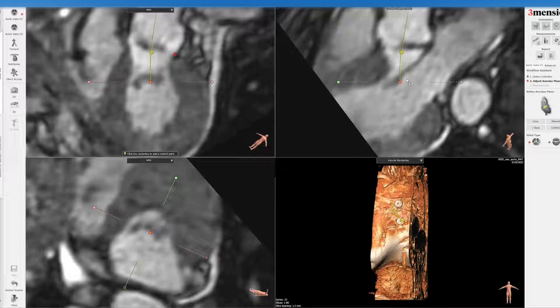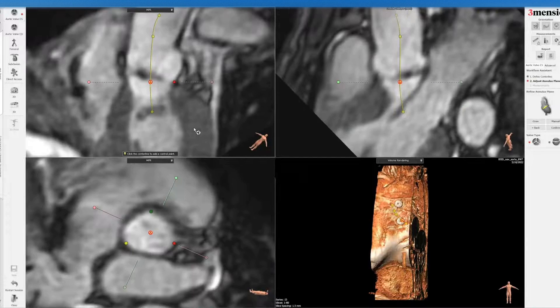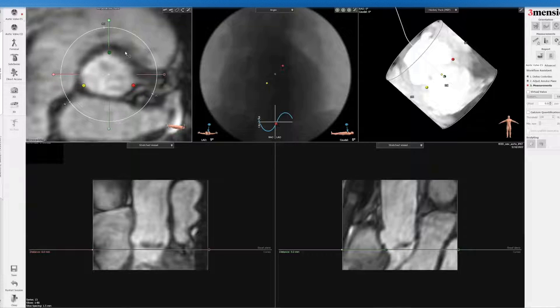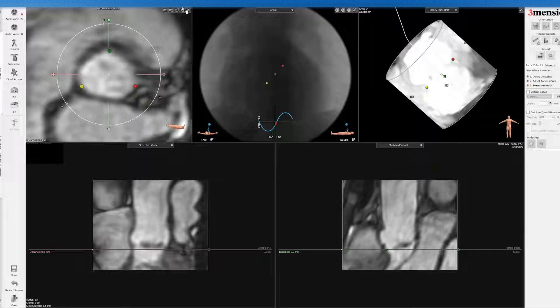You can see in this case the patient is in diastole because the anterior leaflet is open, so it has to be in diastole. Remember, this sizing may be a little bit underestimated versus systole. I click confirm now, and you can see you've got a pretty nice segmentation — I do the same thing as I do with a contrast CT.